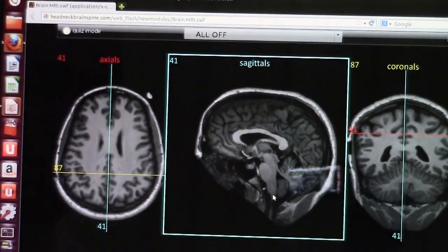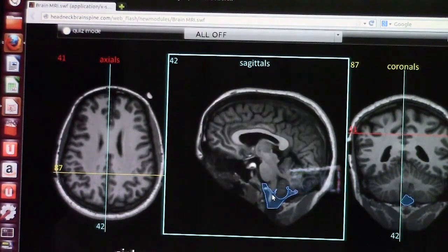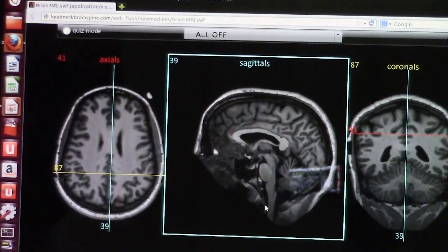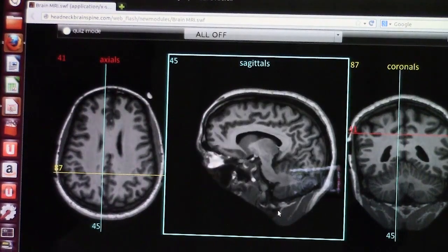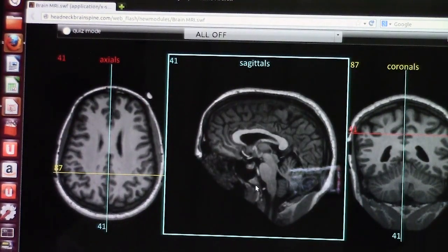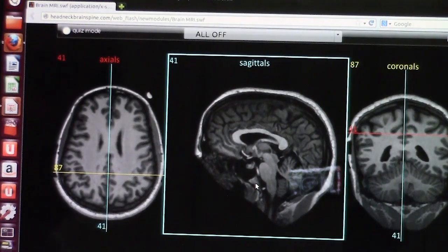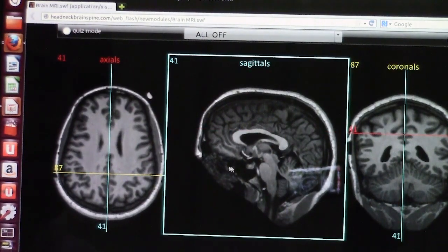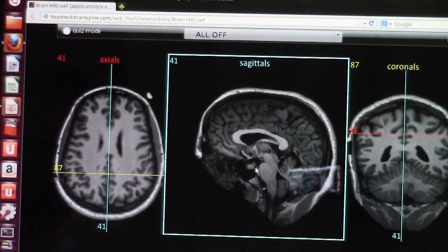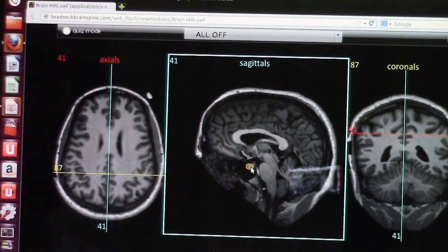Another key structure on sagittal T1 is the clivus — a certain tumor like a clivus chordoma can be seen here. This is the sella turcica, and here you see the pituitary gland. Usually the posterior pituitary looks bright on T1 normally, which is the posterior part of the pituitary gland.